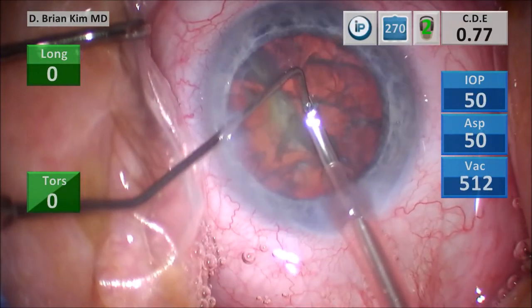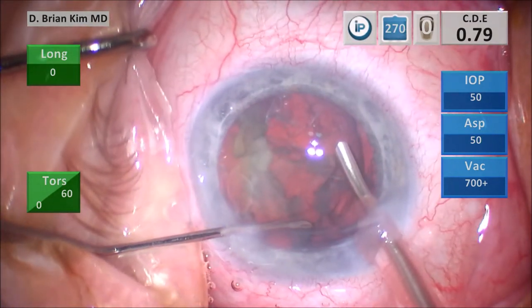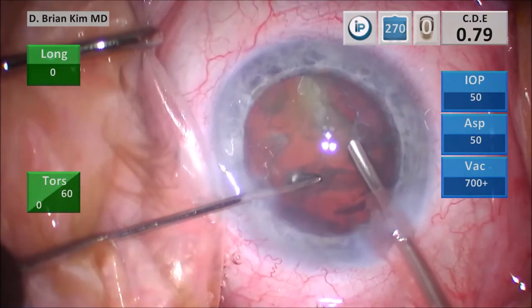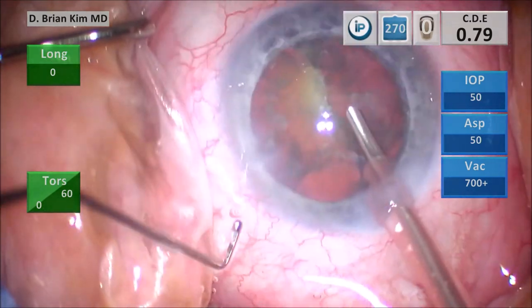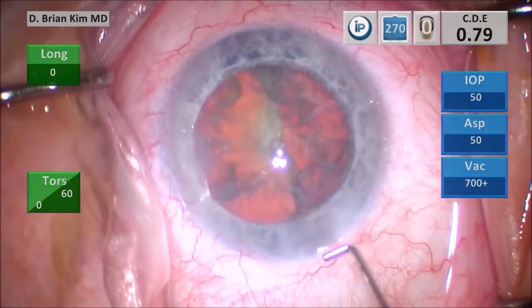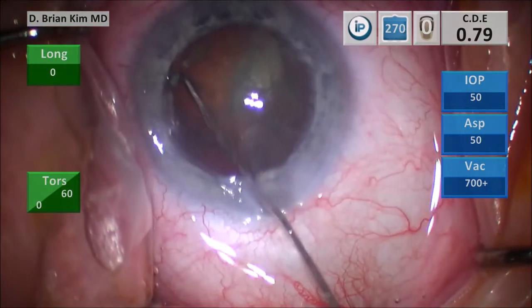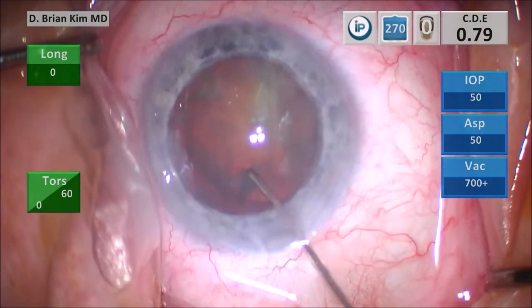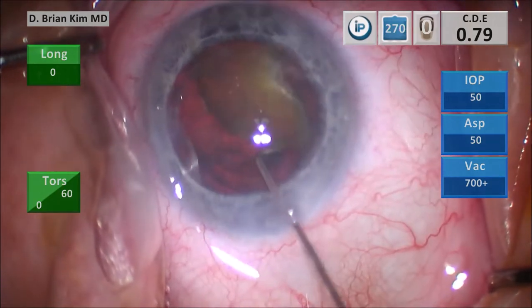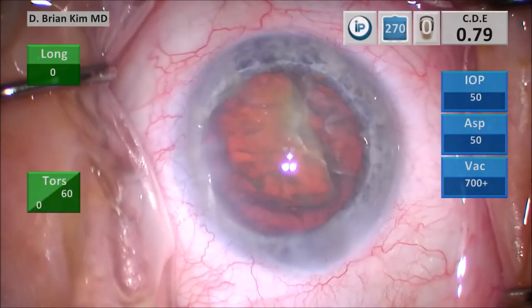Here is when I'm trying to turn the lens and it's really not moving. I could just keep yanking on the lens, but that will stress the zonules. So I don't like doing it that way — I'm going to come out first, and then use my right-angled hydrodissection cannula, the Kim Capsular Fornix cannula. I have no financial interests. I'm rehydrodissecting, and you can see the lens is coming up — this is really the endonucleus coming up. I find the edge of the endonucleus, hook it with the cannula. Since it's a right-angle cannula, I can use it almost as a lens manipulator. I hooked it and just lifted it up out of the bag.